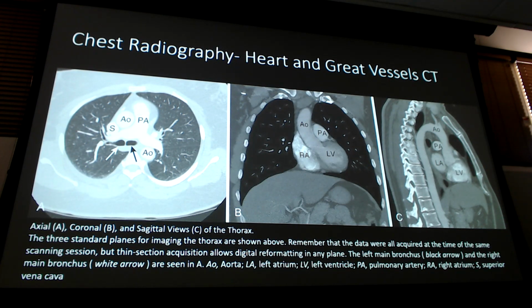Maybe not initially, but if it's not caught and treated, and it blocks the whole area, right? So they have a pulmonary embolism that goes through this branch and into this branch. It's called the saddle one. Another name for the saddle pulmonary embolism: the Widowmaker. It got its name appropriately. So this is the main artery you're looking at when we're looking at those, and we will get to see what that abnormal looks like during this block.